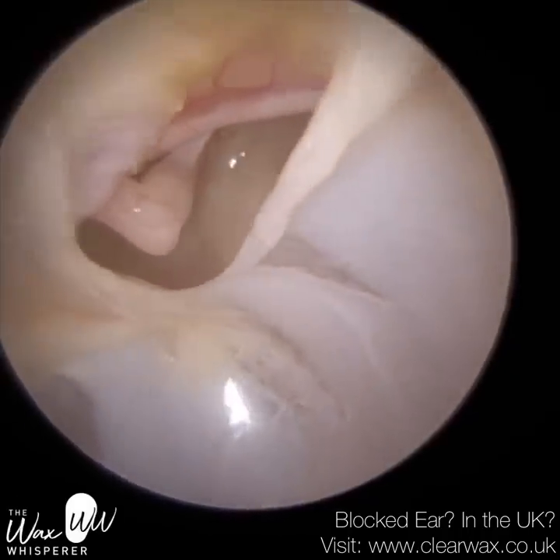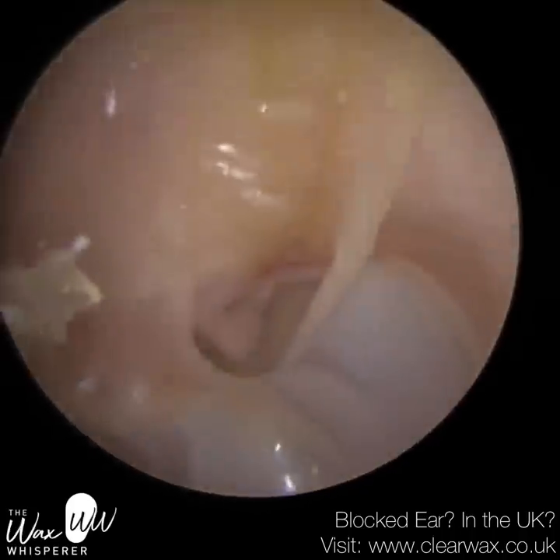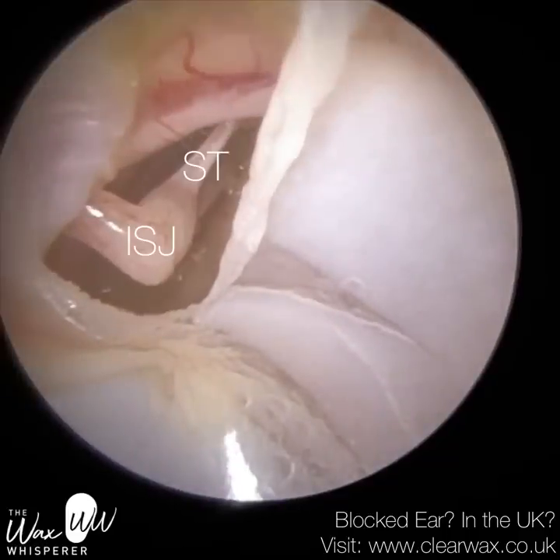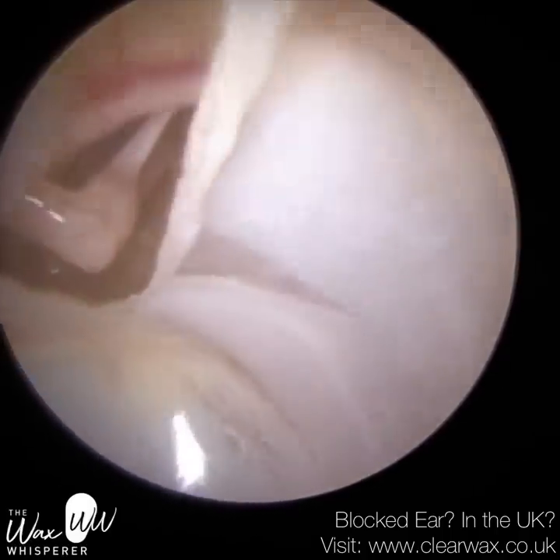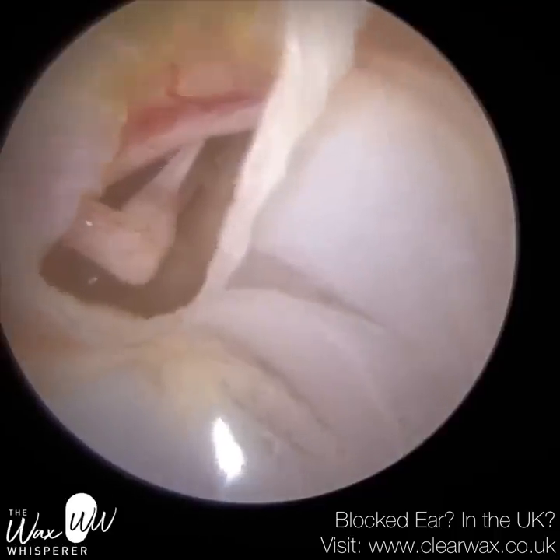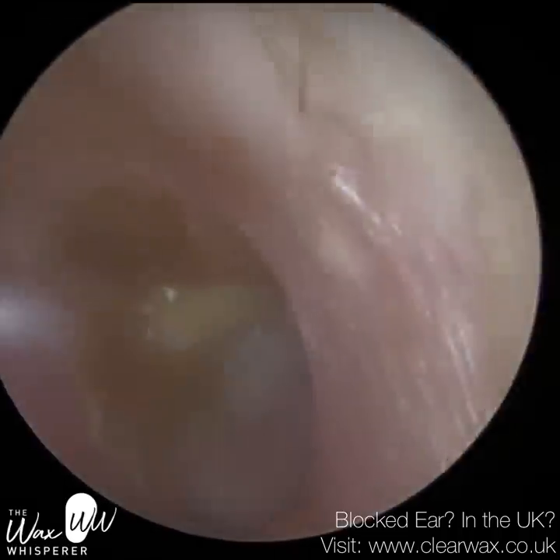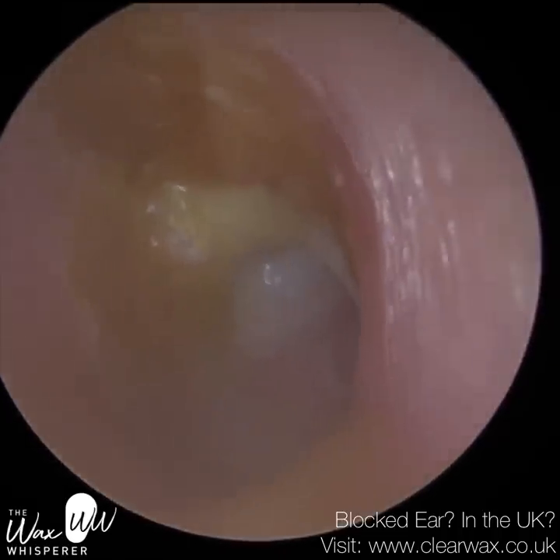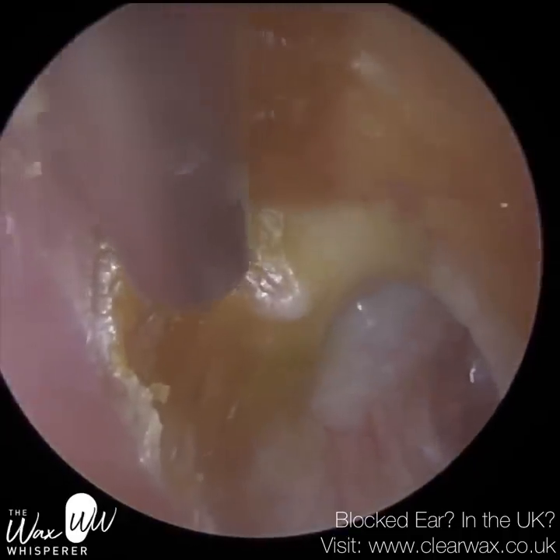You can see that dead skin there at 12 o'clock. The annotation ISJ means the incudostapedal joint — that's where the incus adjoins to the stapes. ST is the stapedial tendon, which is posterior to the neck of the stapes. You can see the annulus of the eardrum as well — that white rim, the perimeter, which is made up of fibrocartilage. That was really interesting. That patient has been referred to ENT. It's unlikely to spontaneously heal because it's been a long-standing perforation given when the patient believes it may have occurred.